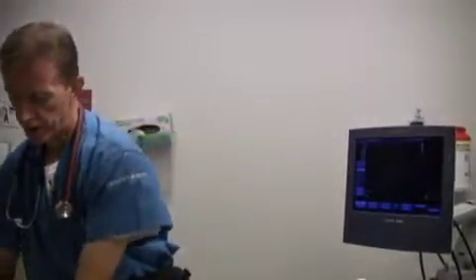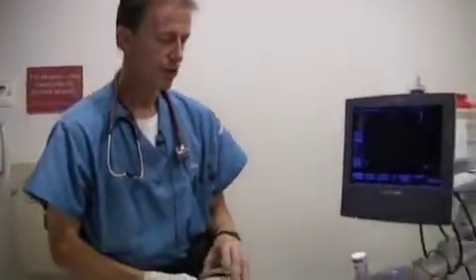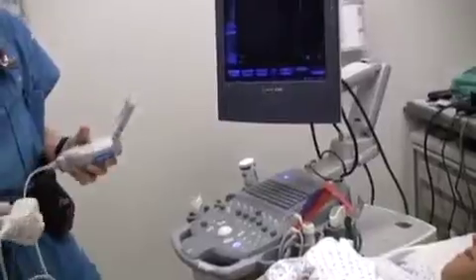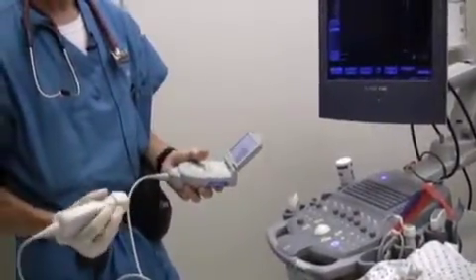We can certainly also in the FAST exam make use of the technological advances mentioned in the introduction. Miniaturization, affordability, and high image quality are the very components of ultrasound technology that are making this available to more and more clinicians. We do actually have a device here which is handheld and is perfectly adequate to do the FAST exam we've just described.